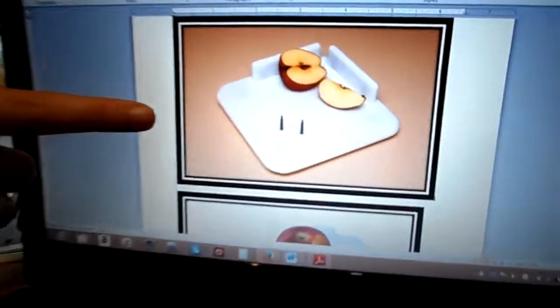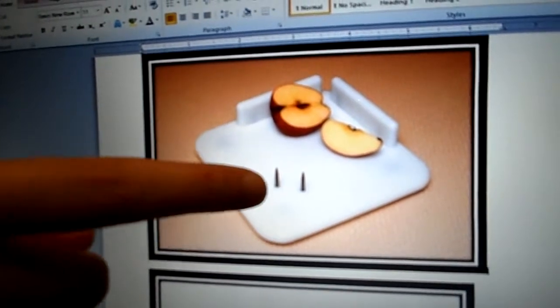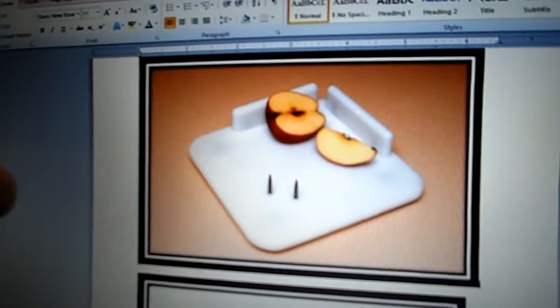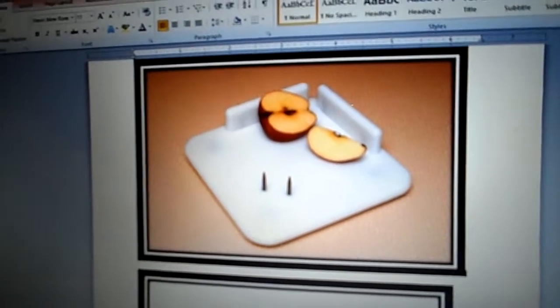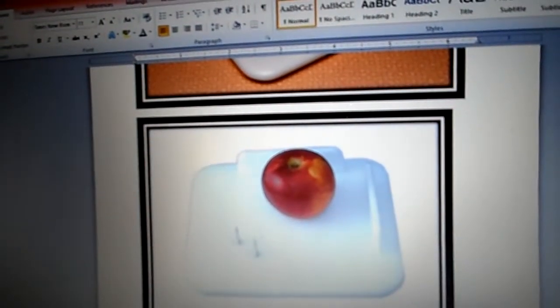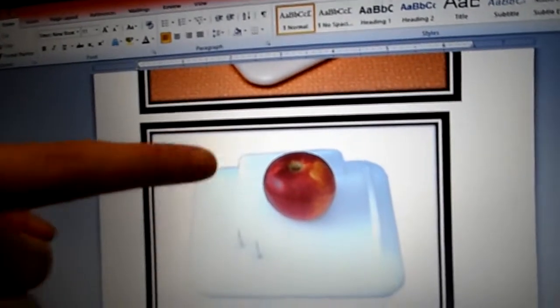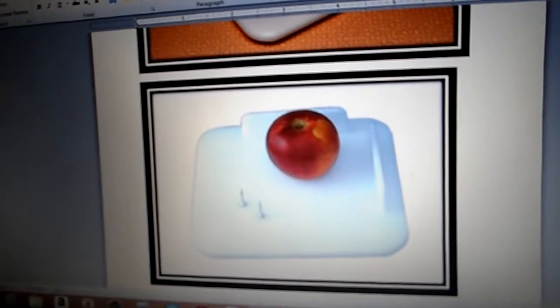And you can buy an adapted cutting board on the market, and I have two examples here. This first one here is from therapyshopdirect.com, and it has two sharp objects to hold the food and a plastic bumper system, and this is actually $121 online. Then I also have this example here, which is the exact same idea, just two screws and a bumper system, and this was $43 on Amazon.com.